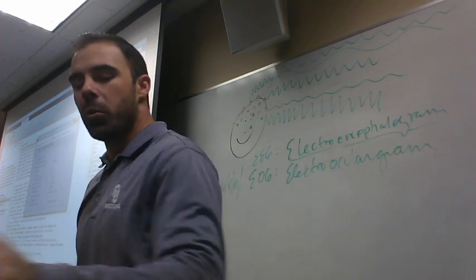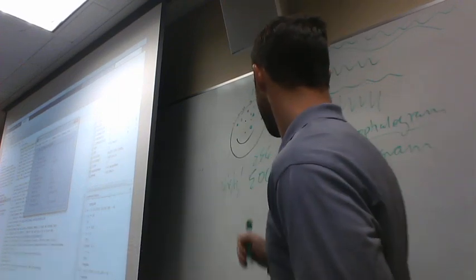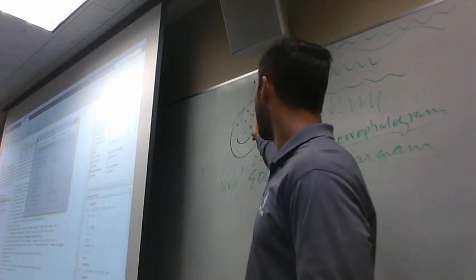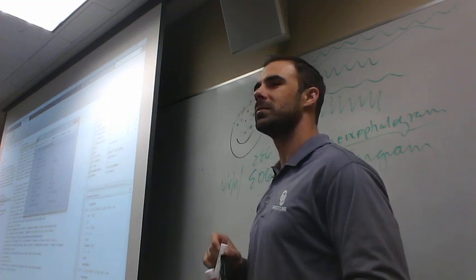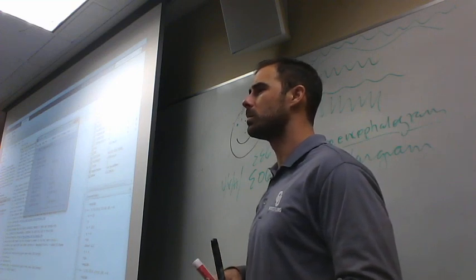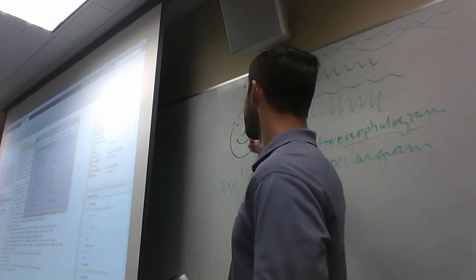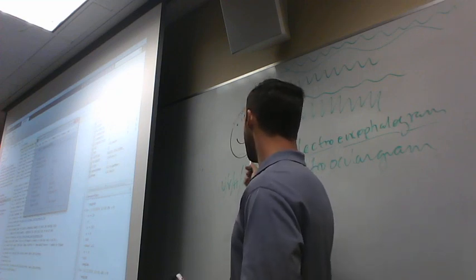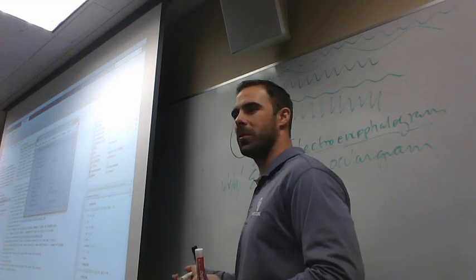So we have this sort of basic setup. What else do we have? What other type of E something G is also being recorded when this is happening? Is that all we're picking up here? You put a bunch of electrodes on a head. Are we picking up straight brain activity and every now and then a little bit of eye activity? Nothing else. Just clean slate. So what else are we picking up?